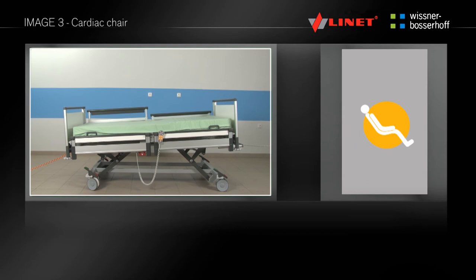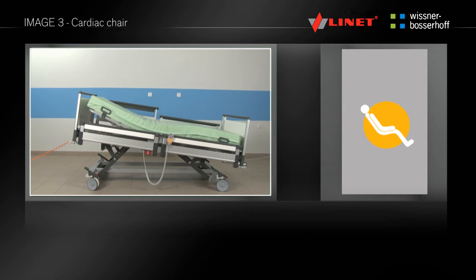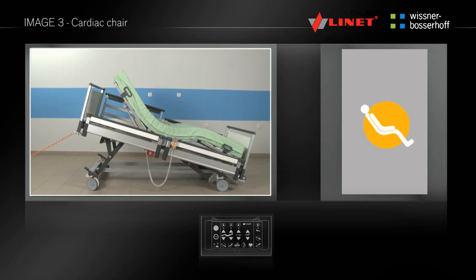To activate the cardiac chair function, press the go button. By pressing and holding the button, you can set the cardiac chair position. The backrest and thigh rest are set to the maximal angle and at the same time the tilting of the bed occurs. This function can be found only on the supervisor control panel in the area of pre-programmed functions.